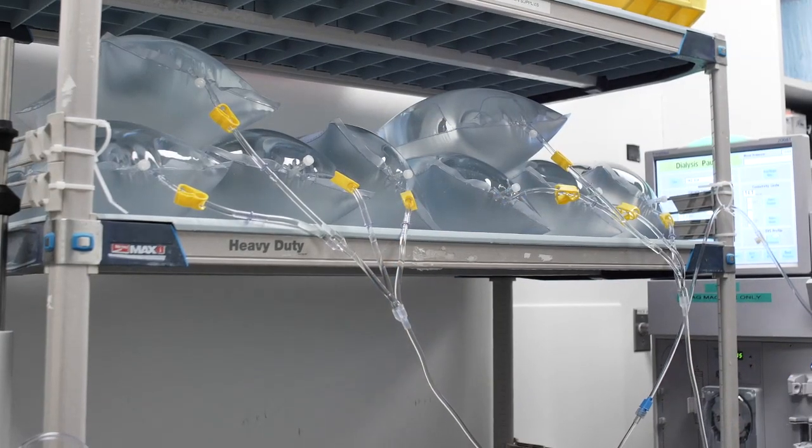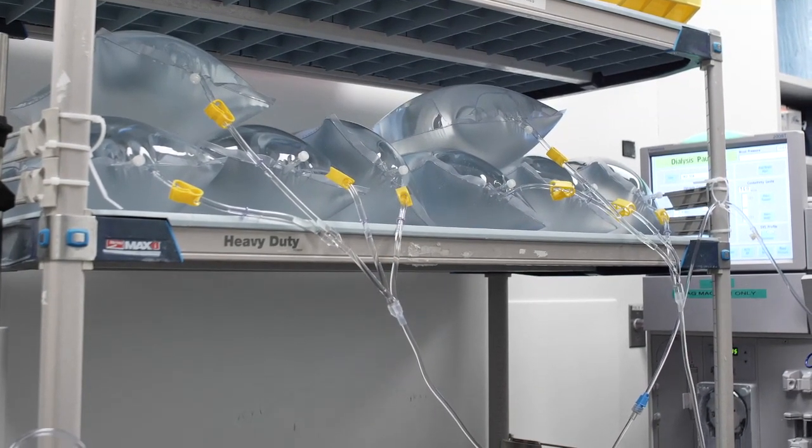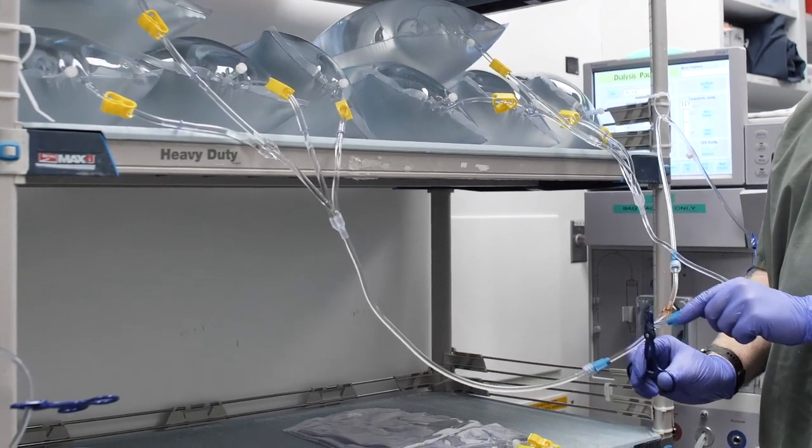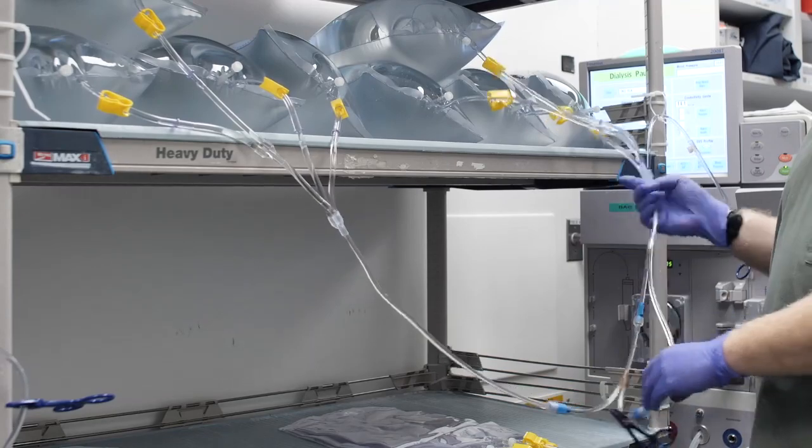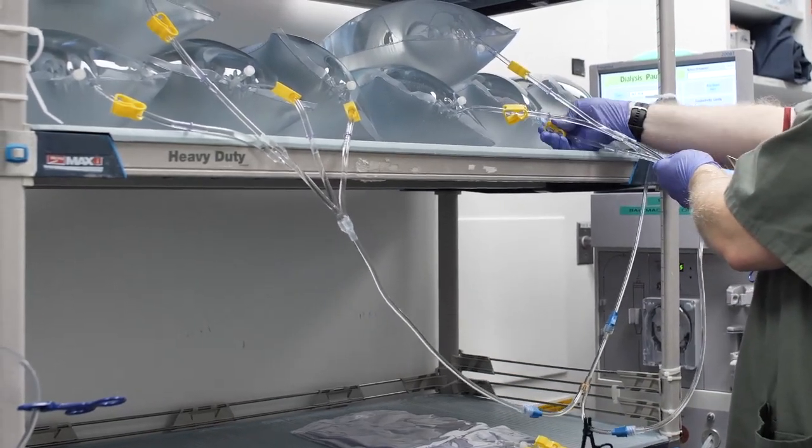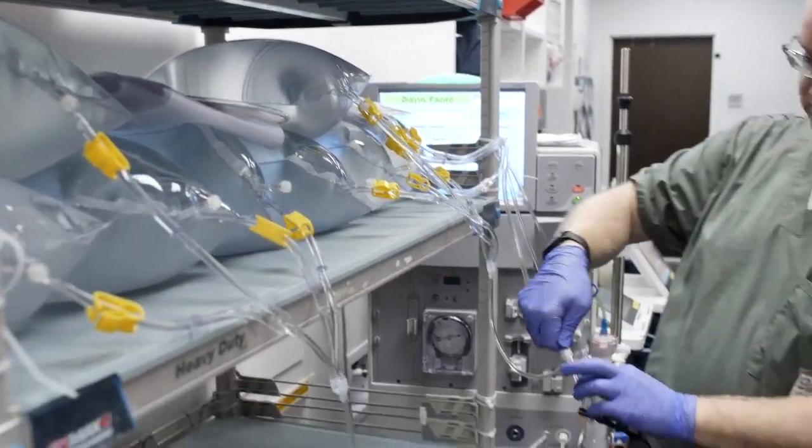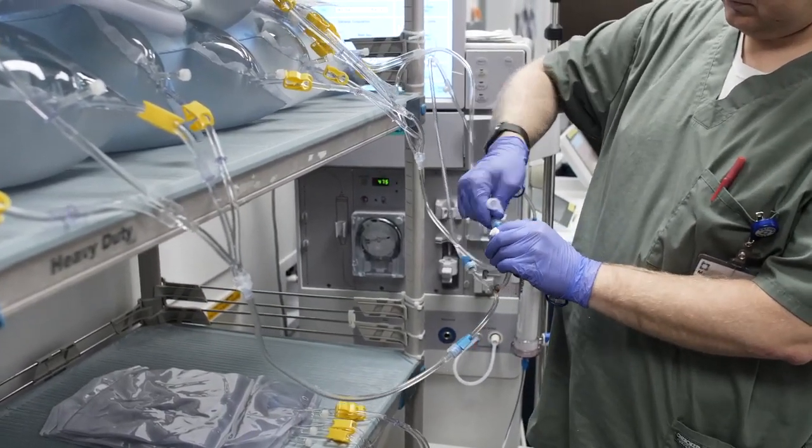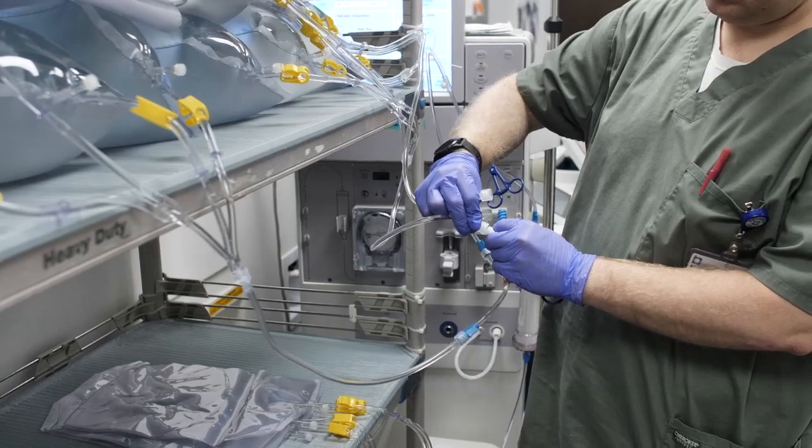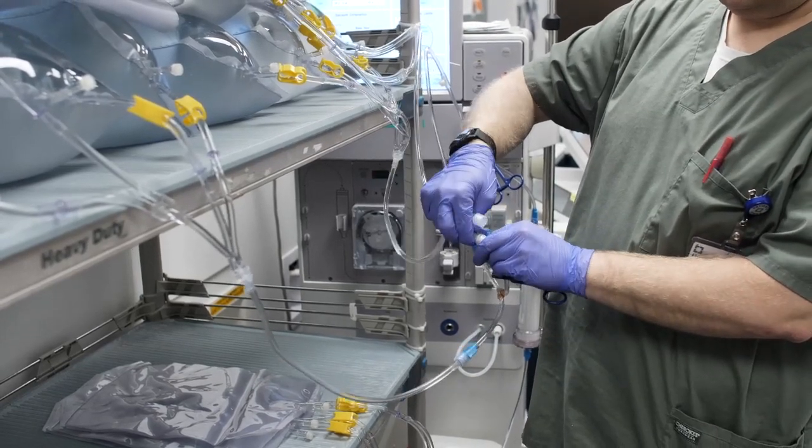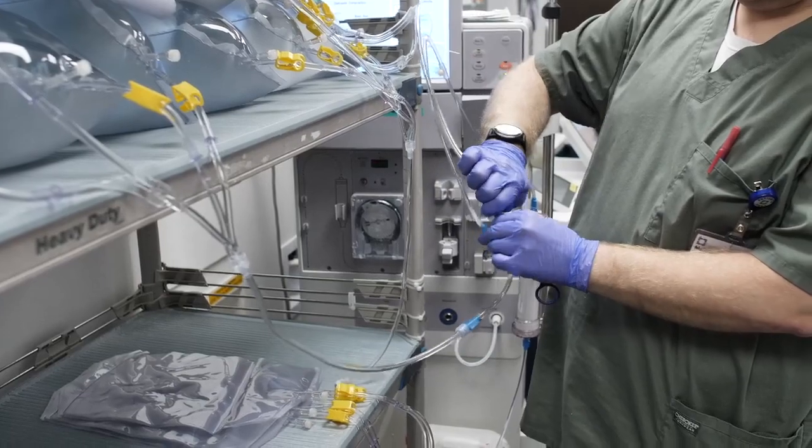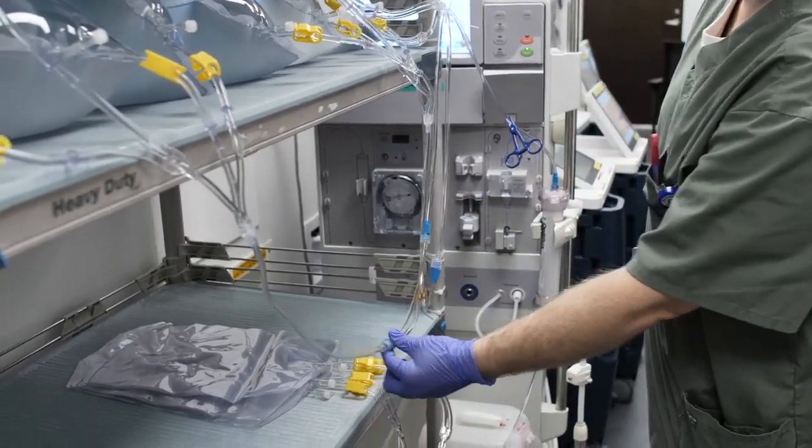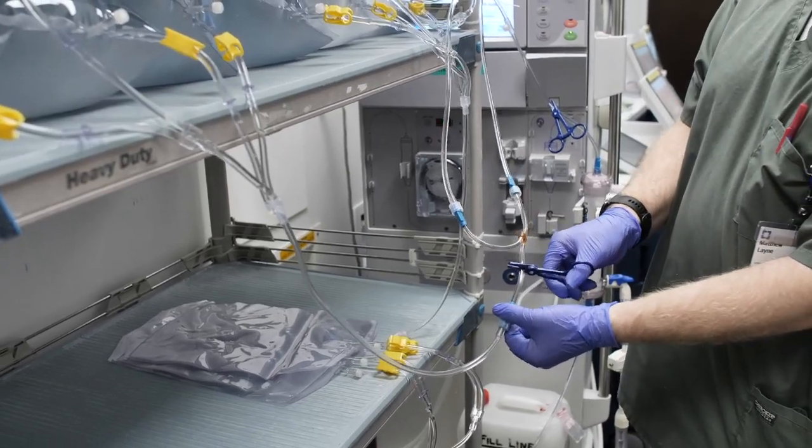Step 19: When the bags are full, place a hemostat on one of the segments on the splitter line. Then close the clamps on the bags of that line. Using aseptic technique, undo the full bags and then take the cap off the new bags and place it on the full bags. Then connect the empty bags to the line and undo the hemostat. Repeat the process for the other line.